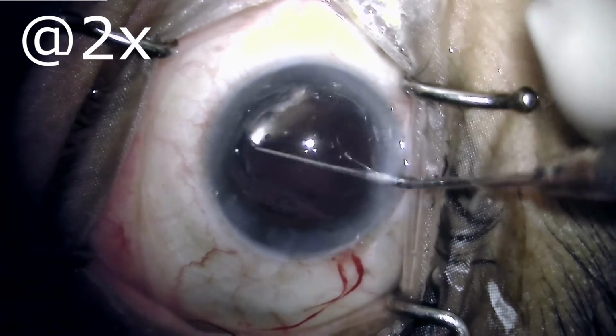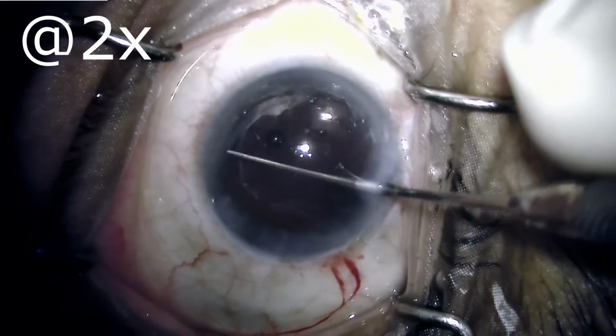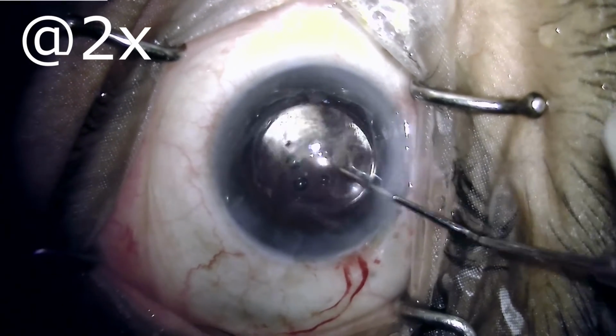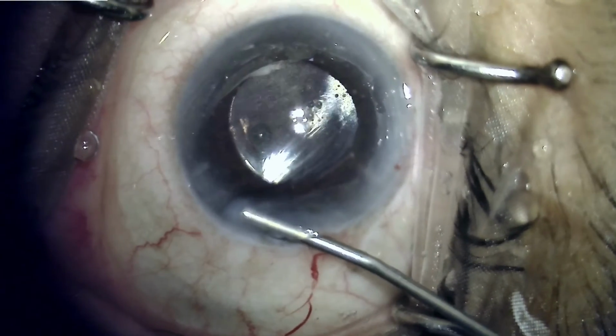Now frequently it is said that a 3-piece IOL should be implanted in the sulcus, but I have been using these hydrophobic monofocal IOLs and implanting them in the sulcus without any unwanted effects for quite some time. So for me this is maybe a debatable issue.